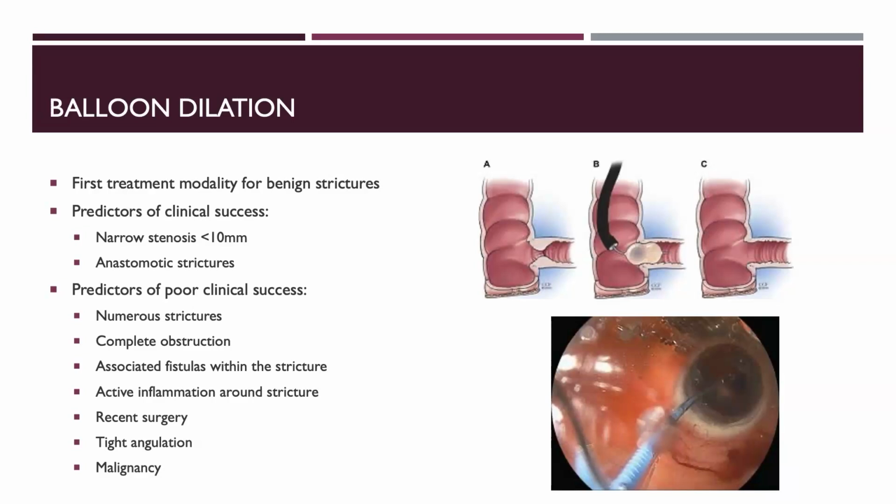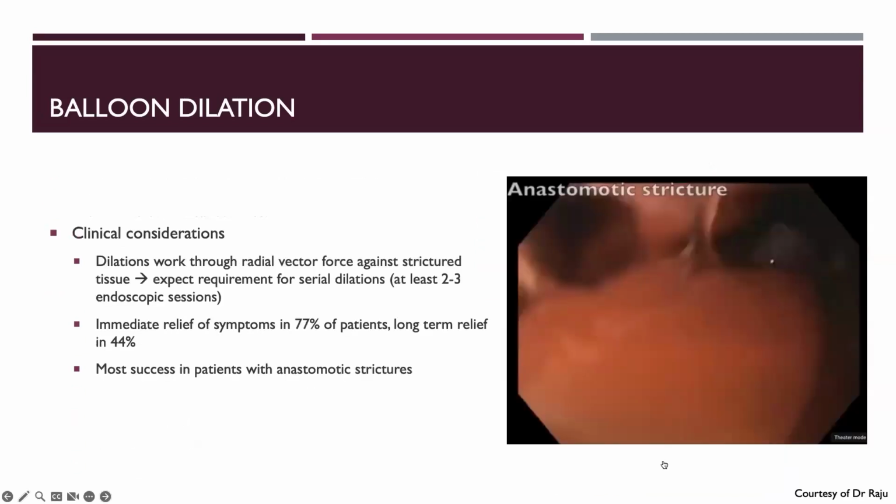And so you may think that you're dilating something, but you're not really breaking any sort of scarring that's happening. All you're really doing is pushing tissue towards the walls, and once the balloon is deflated and removed, give it an hour or two, it's going to come right back in. So for clinical considerations, I'm going to play this video as I talk about it.